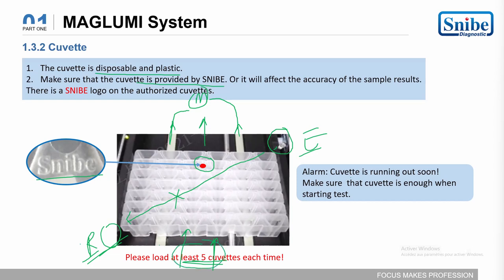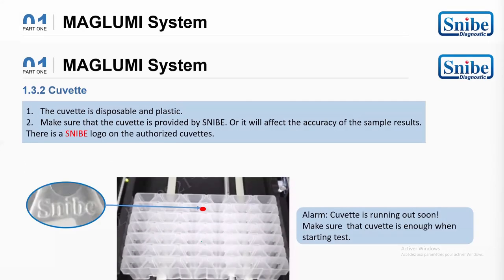In case the cuvettes are not enough on board the analyzer, you can get the message "cuvette is running out soon". So make sure that there are enough cuvettes when starting a test to not get this message. If you get this message, you need to add more cuvettes.